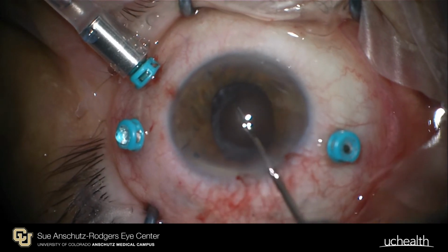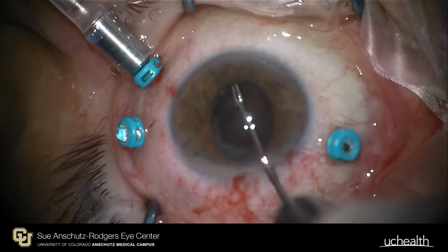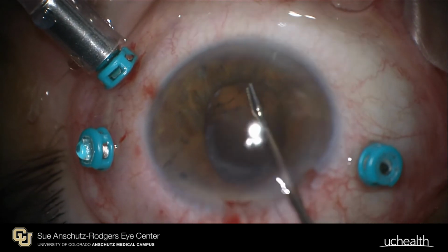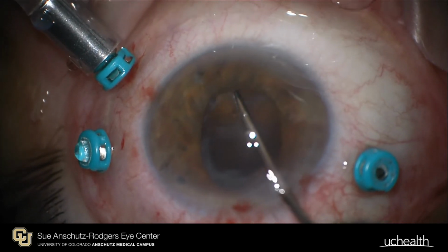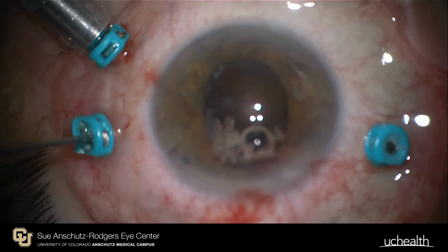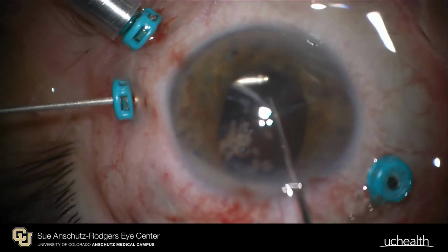When the capsular bag was attempted to be removed by grasping onto the anterior capsular edge, significant tension was noted, and the capsular bag was very immobile. We attempted to proceed slowly in order not to shred the remaining anterior capsule. Initially, this was thought to be due to strong zonular support.